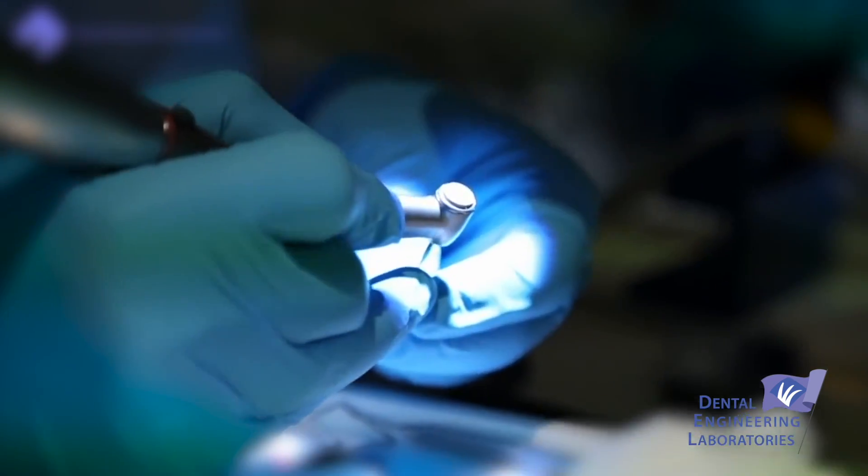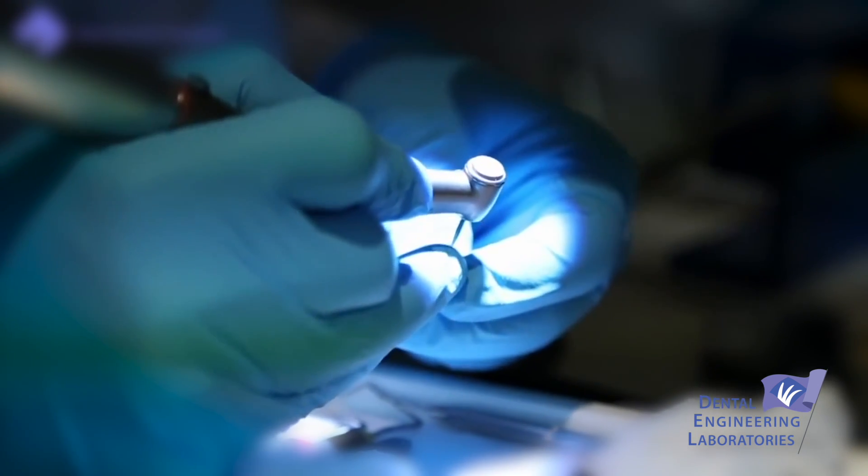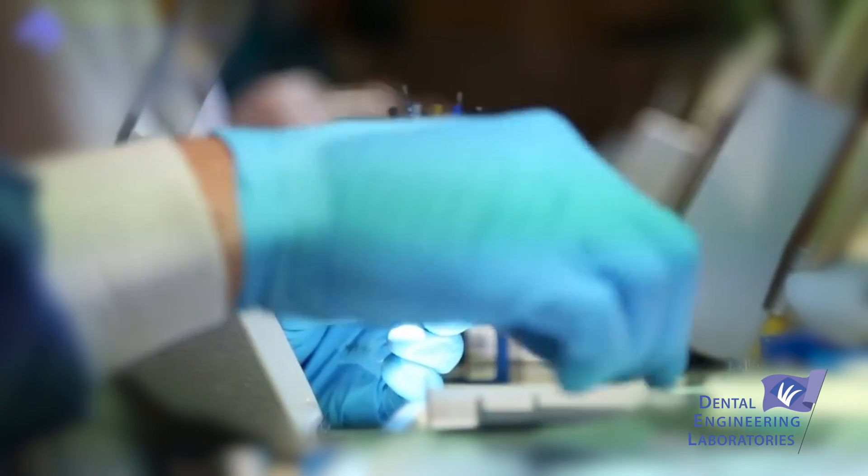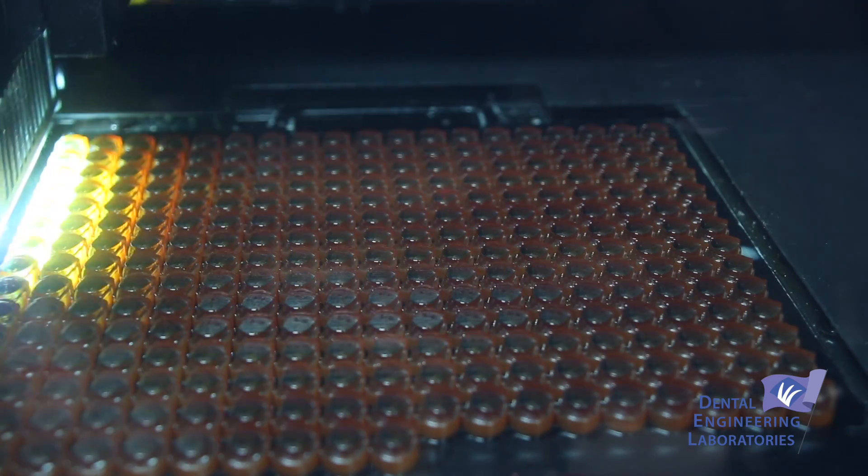I really liked how they felt like natural teeth. The ones I used to work on in dental school — they're plastic teeth — so you just felt like it was cutting a lot harder. These teeth just felt more natural, and I like that there's different anatomy, so there's more challenges, which I liked.